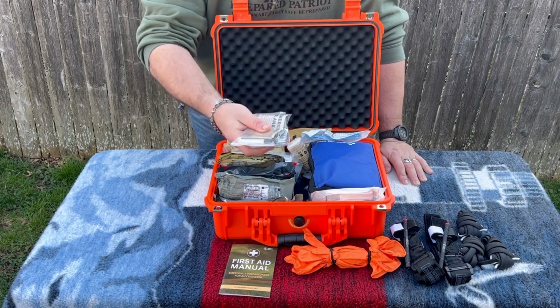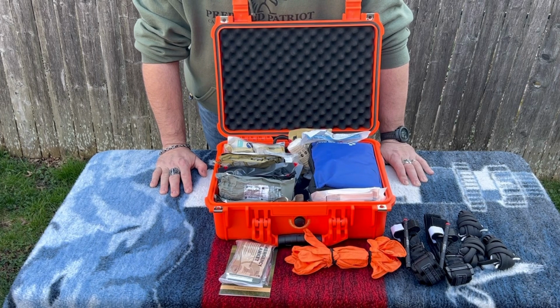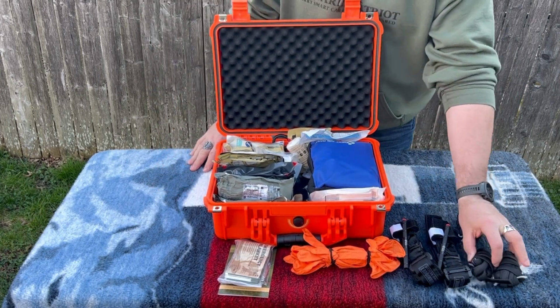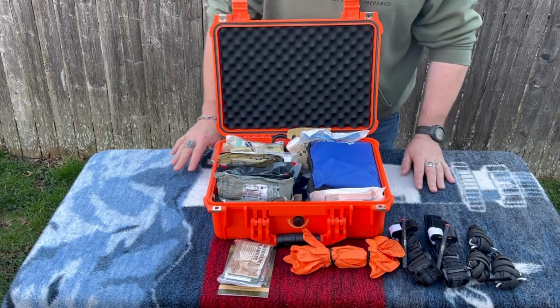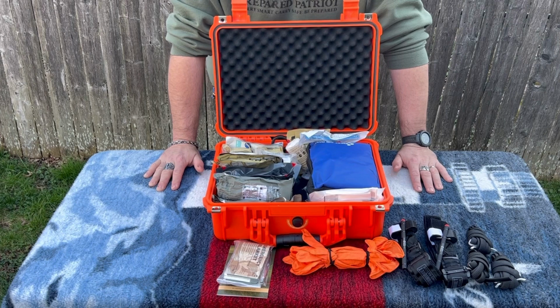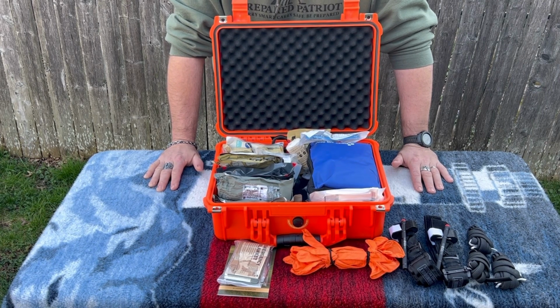Also on top, there's a couple rescue blankets. One of the major things that can kill someone, can sneak up on them especially, is shock. So if you're in an area where, say, you're on a turnpike and help's 10 to 20 minutes away, the simple act of making sure someone's not laying on the ground but is covered with one of those blankets could mean the difference between saving their life or not.